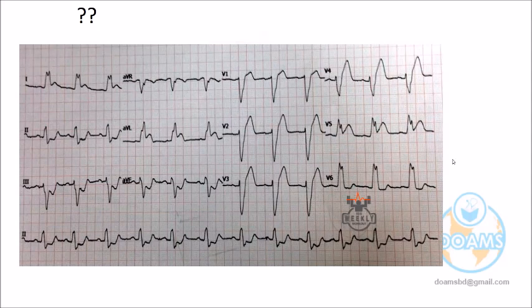Now the next question. Is there any ST elevation, doctor? We are confused, right? V1, V2, ST elevation? Maybe ST elevation.